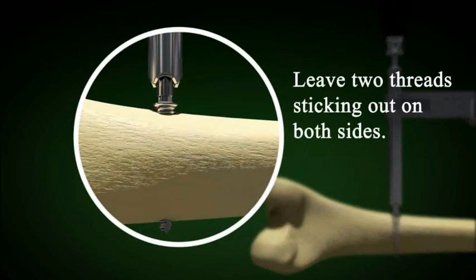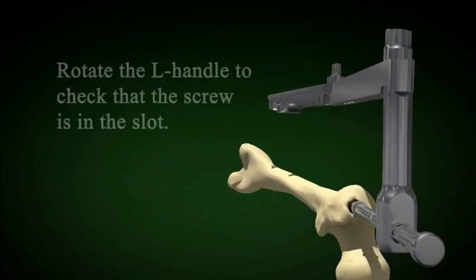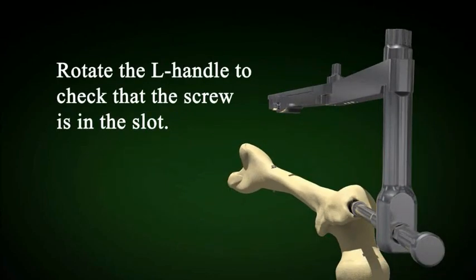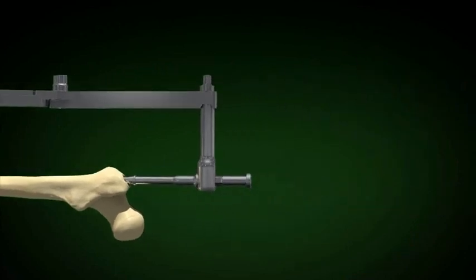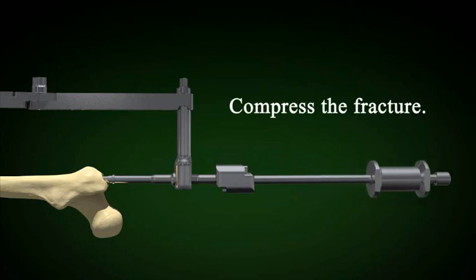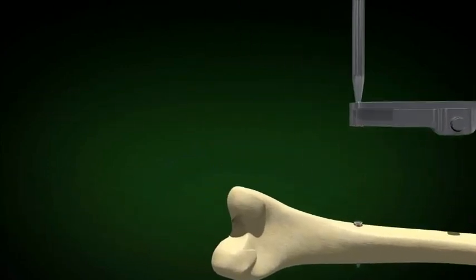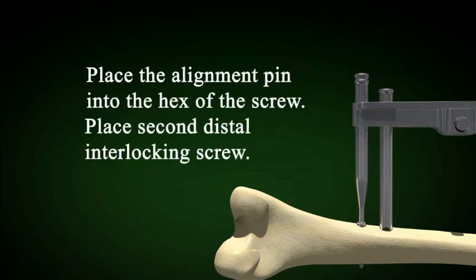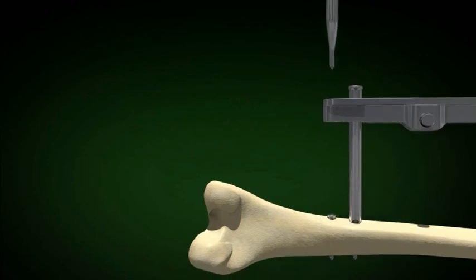Leave two threads sticking out on the far cortex and two threads on the near cortex. Rotate the target arm to confirm the screw is in the slot of the nail and compress the fracture site. If you place a second screw, put an alignment pin in the head of the most distal screw and proceed identically to insert the screw in the second slot distally.